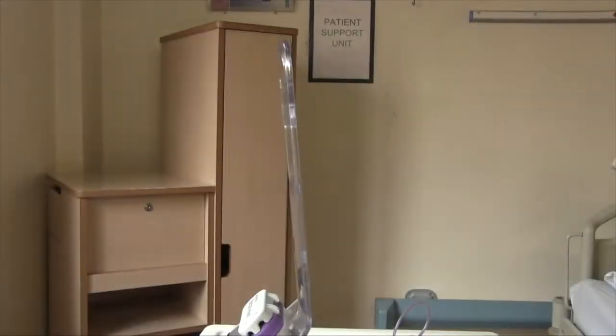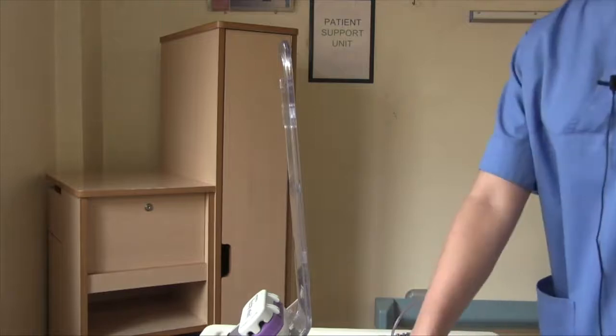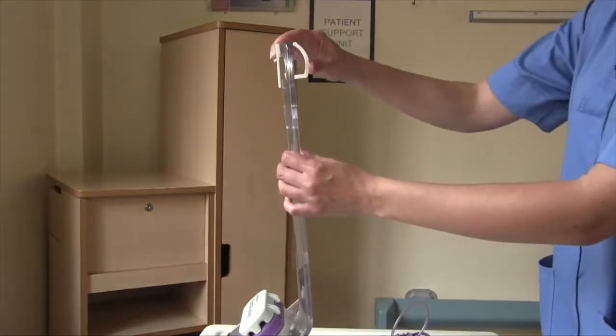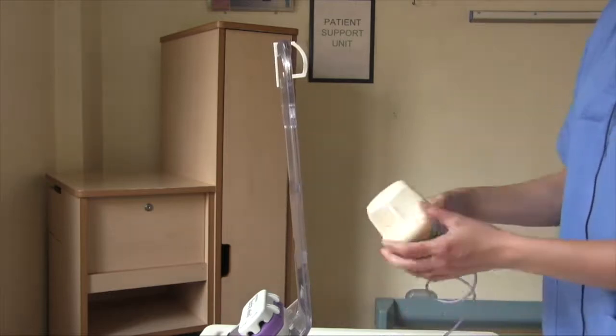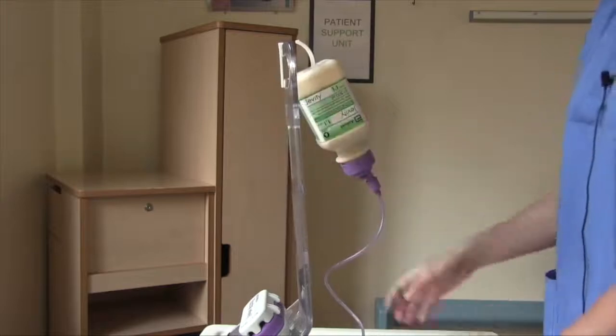Now we will go over how to set up the feed on the stand. Take your Z connector and slip it over the top of the stand with the loop facing the back of the stand. Take your feed, and on the top there will be a loop where you can hook it on to the Z connector. Ensure the feed is on the back of the stand and not on the same side as your pump, as it will tip over.